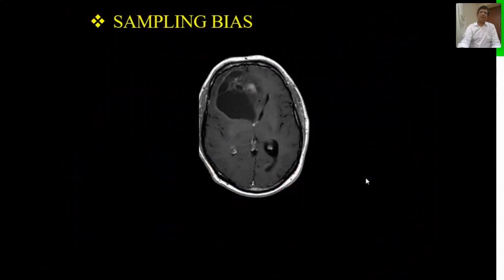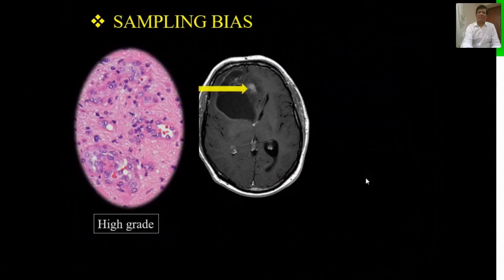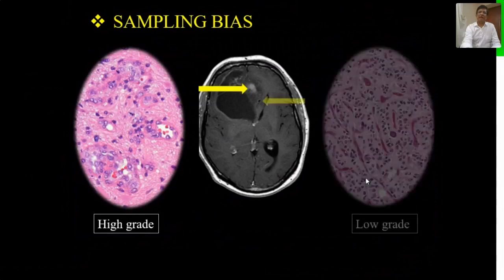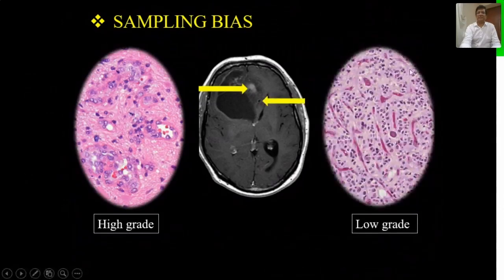One more important consideration is sampling bias. It is our job to tell the neurosurgeon where to biopsy from if he is not going to resect the tumor. For example, in this right frontal lobe tumor, the chance of finding high-grade changes is better in the intensely enhancing area compared to its corpus callosum part, which will show low-grade tumor.